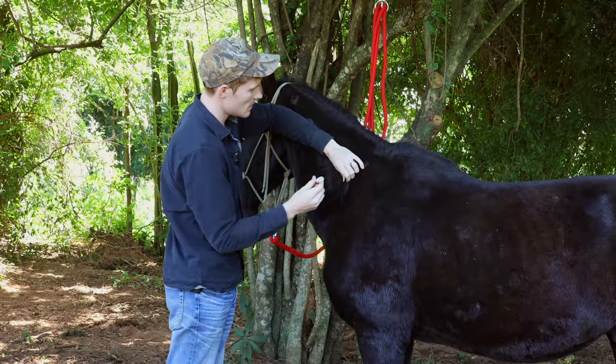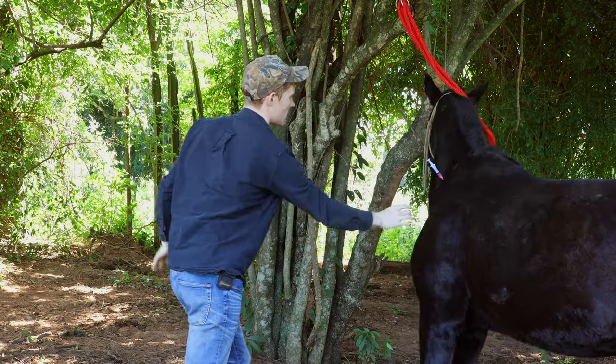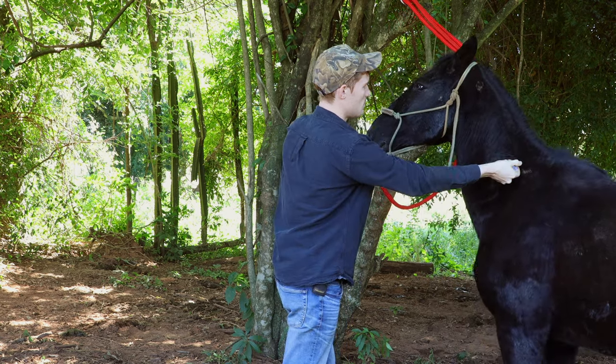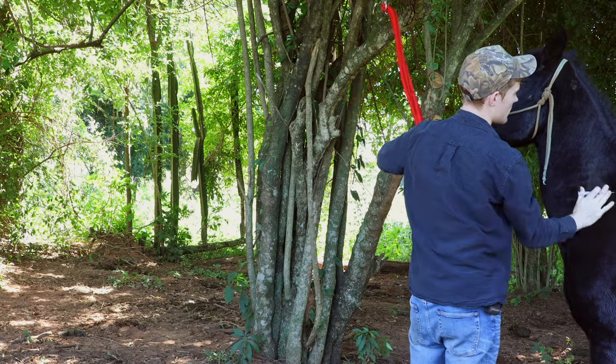So I'm going to go ahead and nip it up, and then I'm just going to tap him, tap him, tap him, stick it in. Now if that happens, there's no worries — just kind of get up close to him and see if you can put it in, and then we're going to pull it out and rub it away.